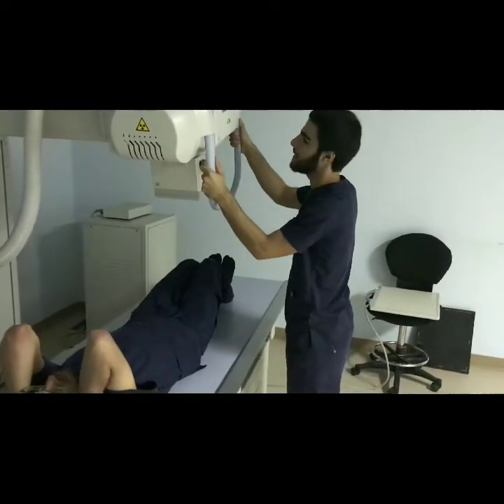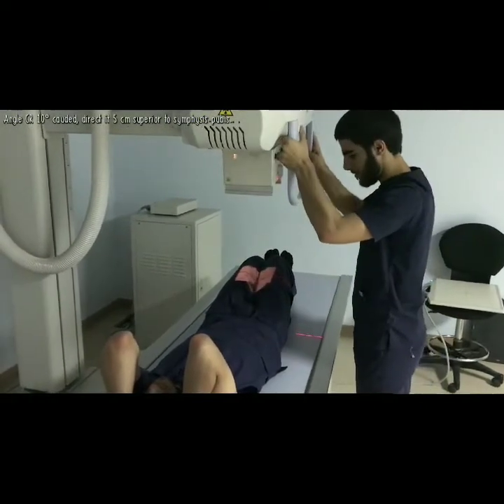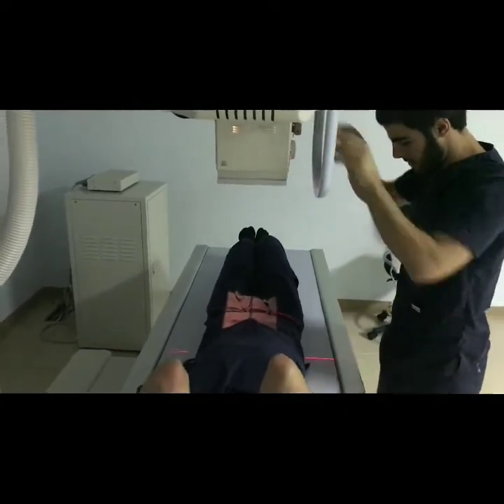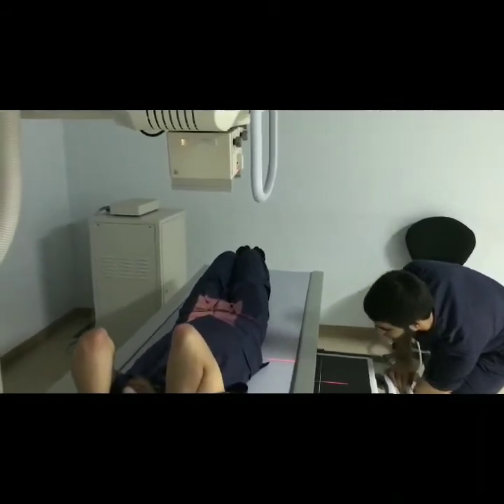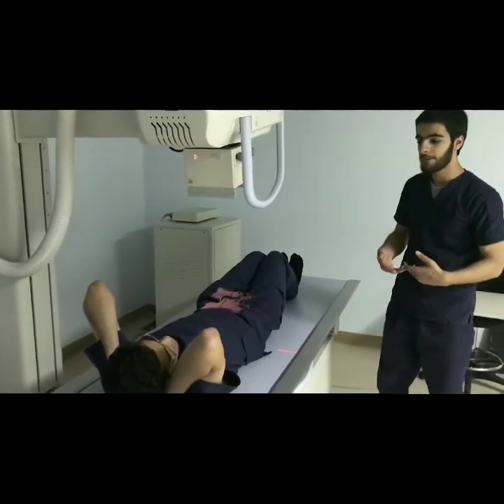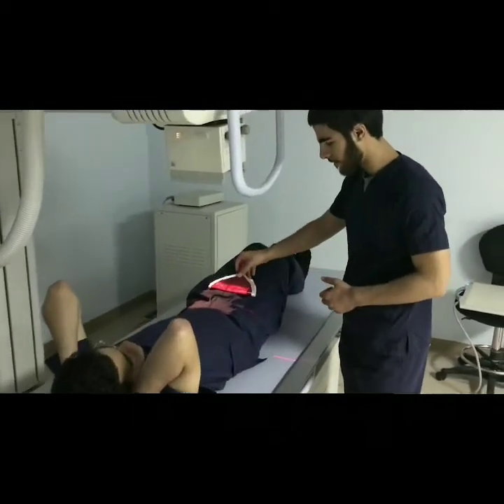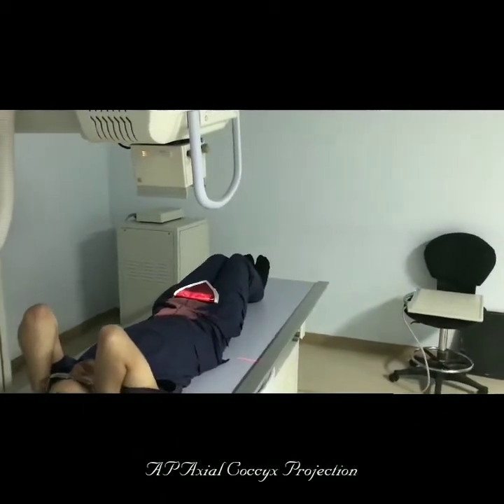Angulate the x-ray tube to 10 degrees caudad for the axial coccyx projection, which of course differs between patients depending on curvature. Make sure the central ray is the same. Collimation is slightly decreased lengthwise while everything else remains the same. Explain to the patient how he's supposed to breathe, place the lead shield for males, double check, and leave to take the image.